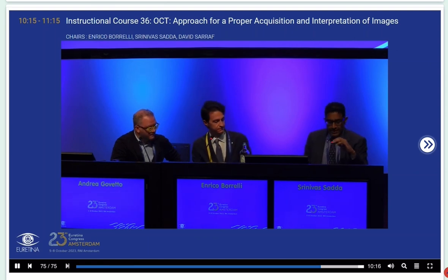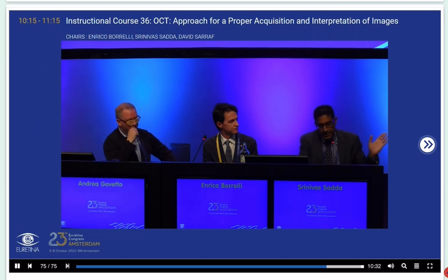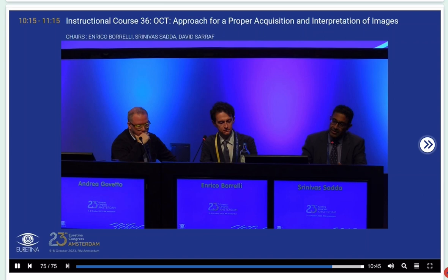Just for OCT. Yeah, I don't think there's a need to do another acquisition. I think a single dense volume with a modest amount of averaging is sufficient for most of our purposes. Really, one thing I didn't mention is training your photographer or whoever is doing the acquisition, if the quality of the image isn't good, to repeat it. So I don't think you need to necessarily obtain multiple. It's more a matter of actually spending time to train the person acquiring the images that if they didn't get good images to repeat them, because it's always such a regret, right, when you're trying to do a study and you can't go back, you can't get it.